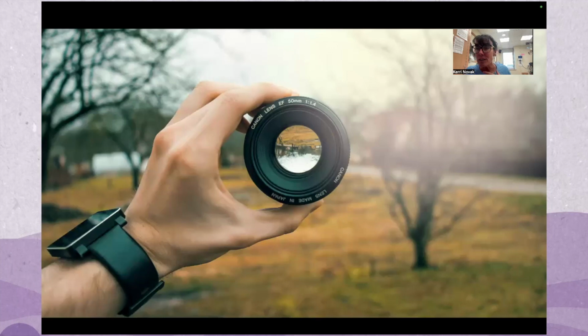Now, we've talked about symptoms, biomarkers or blood tests, stool tests, as well as endoscopy, but that only gives us part of the picture. We also do cross-sectional imaging so that we can look at the bowel in cross-section. So the bowel actually has 5 layers. So we need to see each of those layers and understand which are affected.